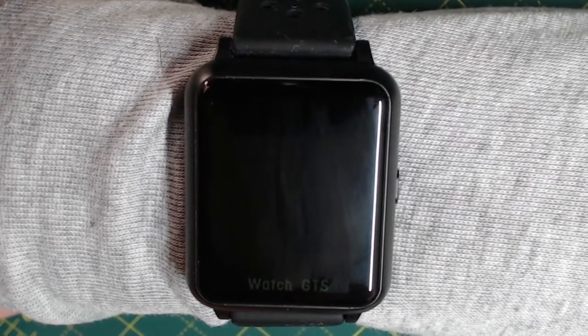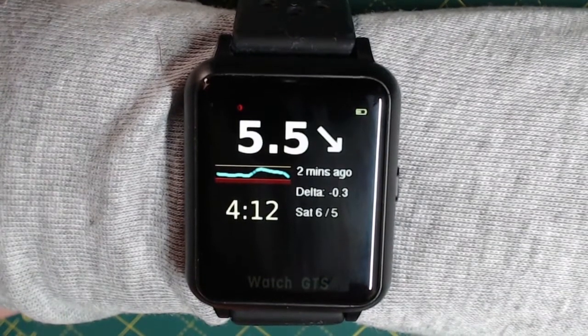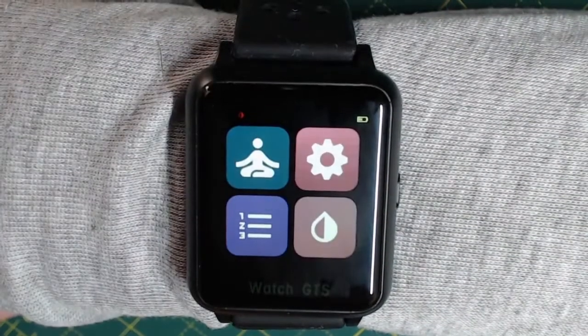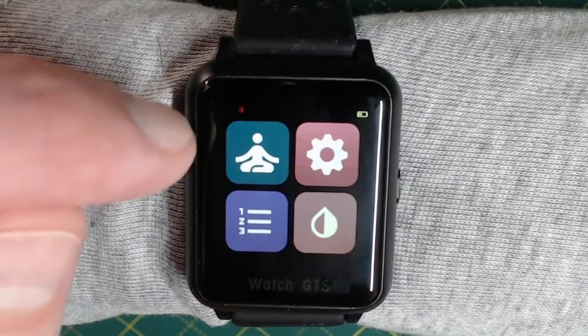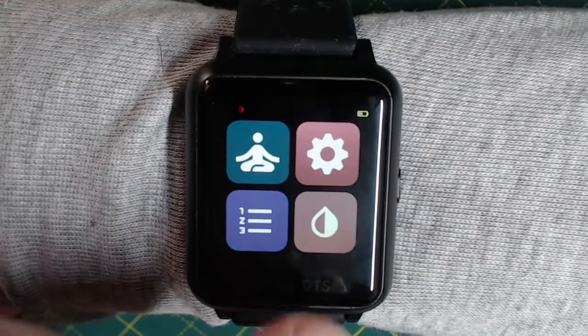First things: how to wake the screen. Just swipe upwards. Once the screen is illuminated, you can swipe down to display the menu page. Here on this first screen you've got four different menu items: there's the user menu, settings menu, information menu, and the Xtrip Core menu.